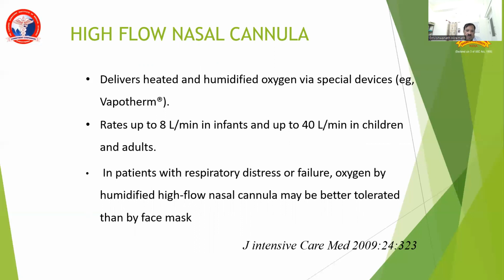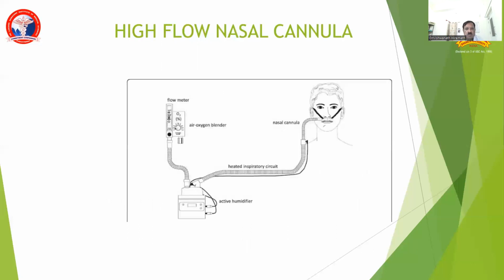In patients with respiratory distress or severe respiratory failure, oxygen by the humidified high flow nasal cannula may be better tolerated than by face masks. This is a special device through which heated and humidified oxygen will be delivered.